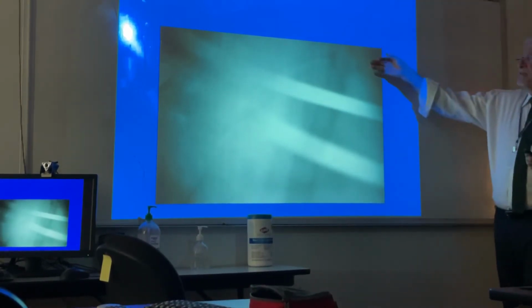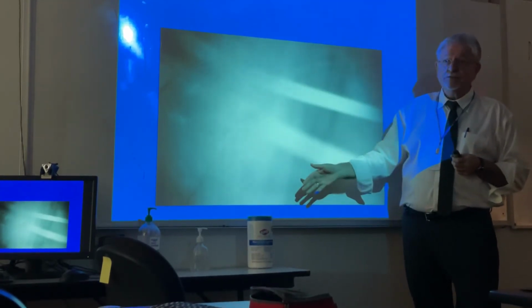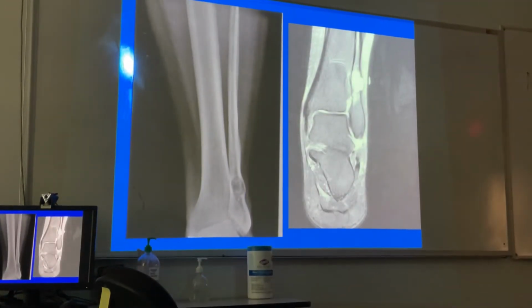That's the beauty of the new digital system. It can pick up things that we weren't able to pick up previously, and there are so many dots that it can overcome some artifacts. So this is conventional X-ray. These days, the biggest artifact is clothing, rings. And I guess rings are part of clothing. Okay, what else do I have?